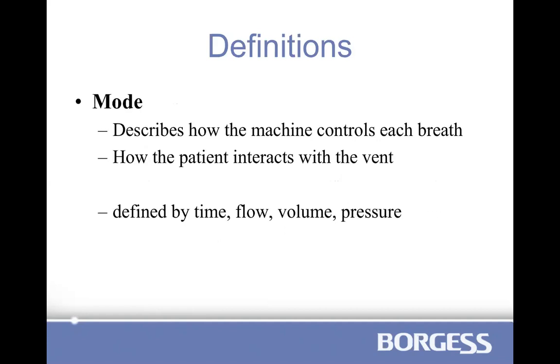We'll come back to why the plateau pressure is so important to know on a ventilator, because it is something that can cause barotrauma. And again, going back to our basics, we don't want to cause more harm. So, the modes on the ventilator. Number one, I will tell you that you can oxygenate and you can ventilate a patient on any mode of choice on a ventilator. Although it's good to understand all of the different types of modes, what you set and what you monitor, so that if the patient is telling you that this mode is not working for them, you know how to adjust things to achieve your goal.